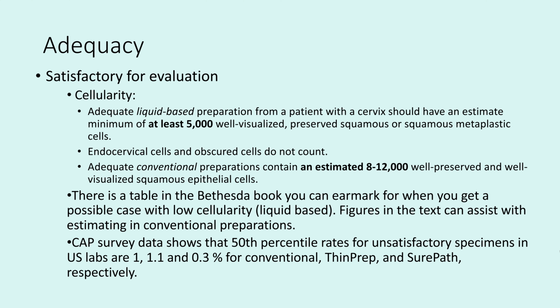I don't really see these kinds of specimens as commonly, but an adequate specimen for liquid-based is at least 5,000 well-visualized, preserved squamous or squamous metaplastic cells. Endocervical cells and obscured cells do not count for either kind of prep.